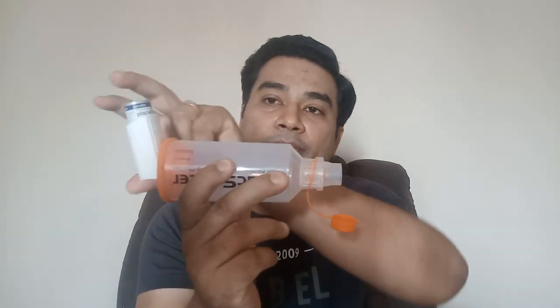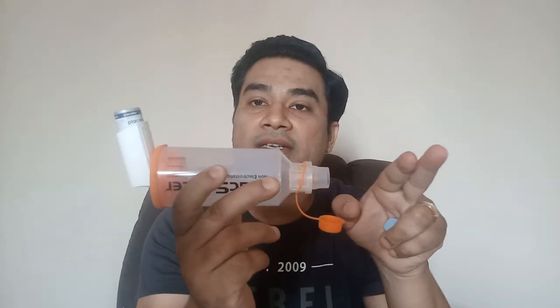So this is the mouthpiece. You have to keep in mind there is a valve here, and you have to inhale in this and exhale in this only. Firstly, this canister contains the medicine. If I press it here, then the medicine is delivered here, and I inhale and exhale from this part. The procedure is one press, five inhales, five exhales.